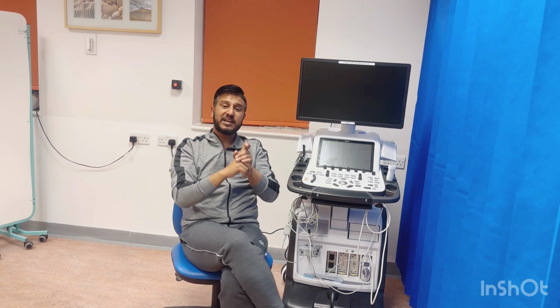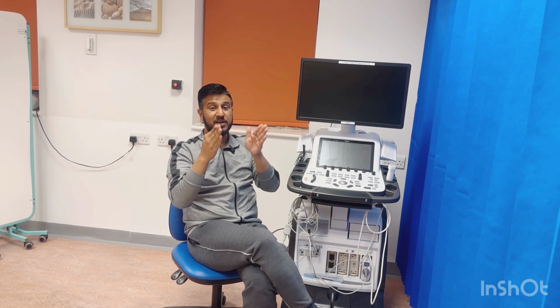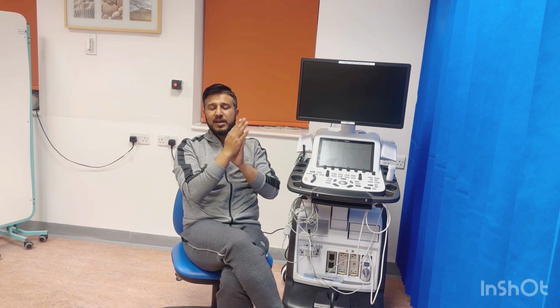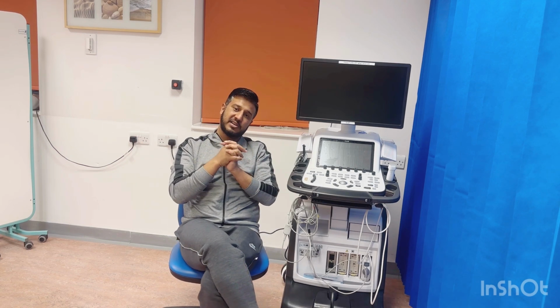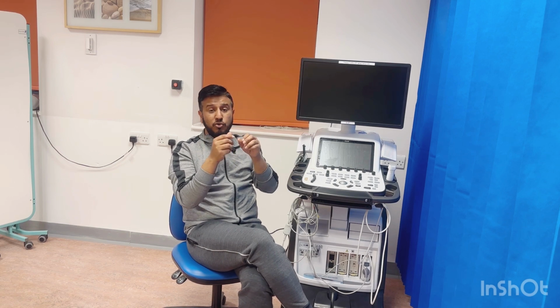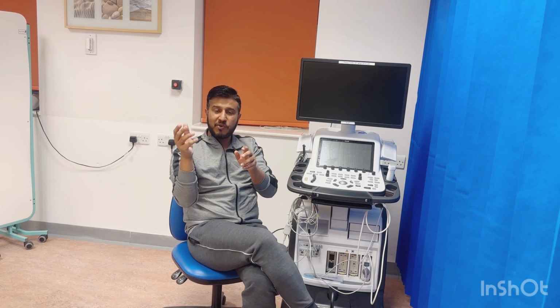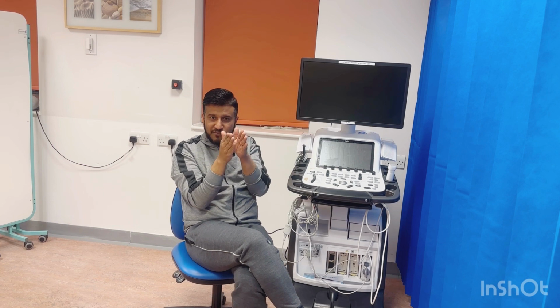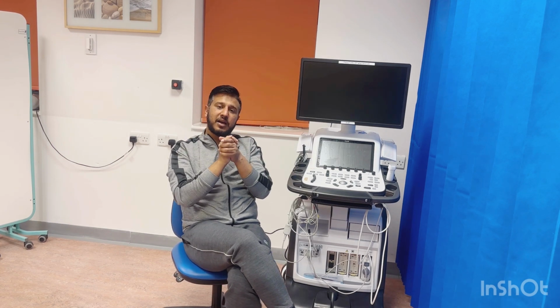Second thing is we are looking for holodiastolic flow reversal. We can have a very small reversal in early diastole. That's normal, no problem. But if you see a full diastolic flow reversal, it means there is aortic regurgitation. And when you are getting that flow, you need to decrease your scale, because you are talking about 2 millimeters, 5 millimeters of flow. You are not going to have a very high velocity flow. You are going to have very low velocity flow. So you need to decrease your scale to see that flow better.